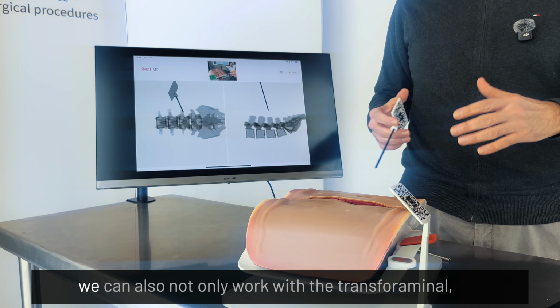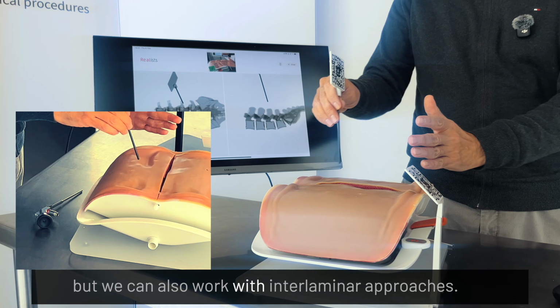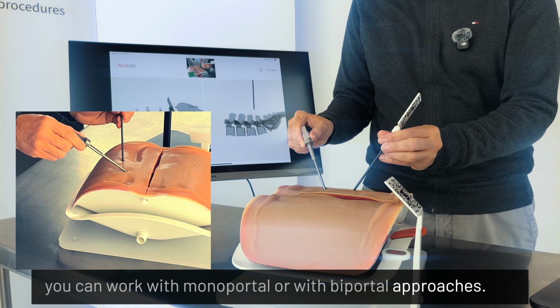Okay, with this model we can not only work with the transforaminal, but we can also work with interlaminar approaches. In the same way you can work with monoportal or with biportal approaches.